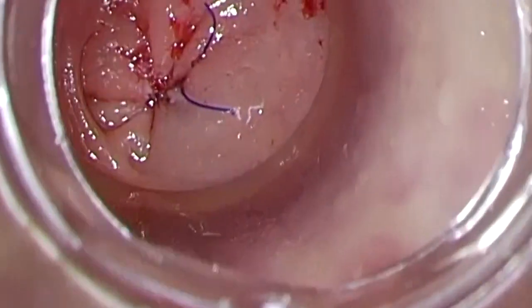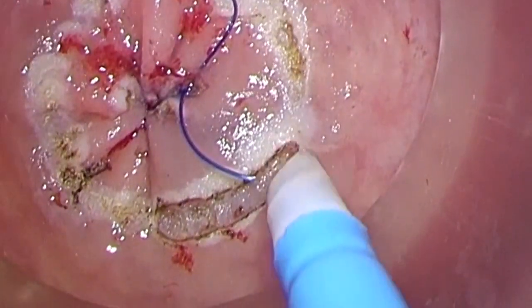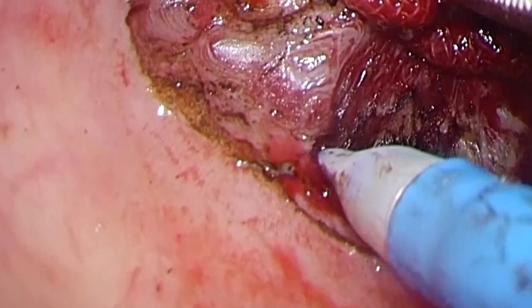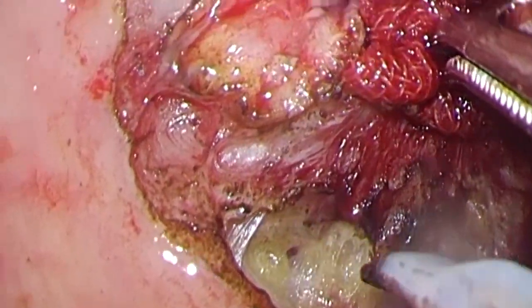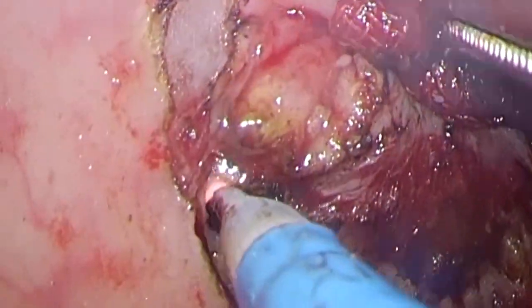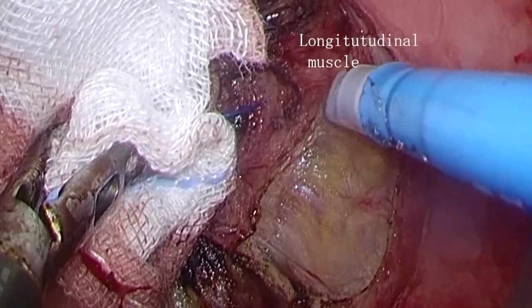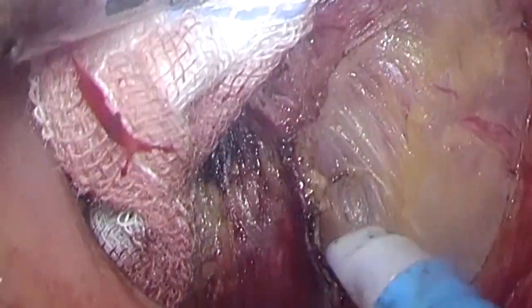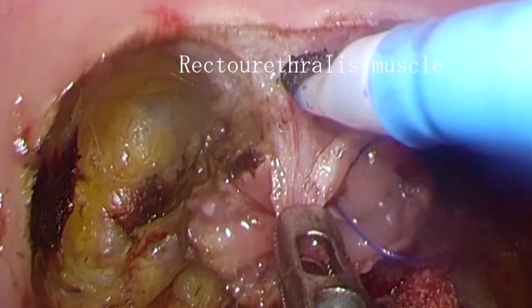Transanal approach with two teams. After closure of the rectum with purse string sutures, a full thickness cut of the rectum was made. The rectourethralis muscle was then dissected.